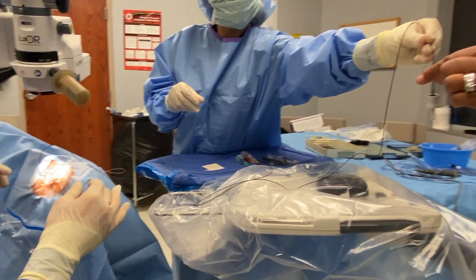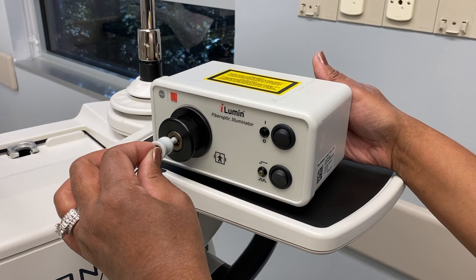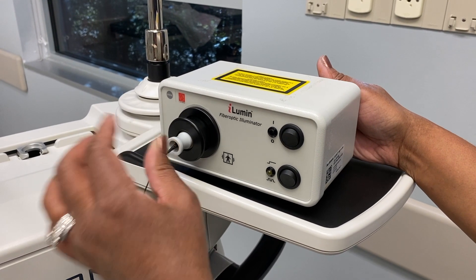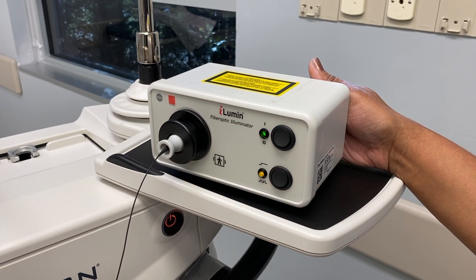The fiber optic connector is then passed off and the circulator snaps it into the black ring of the eye lumen. The upper switch turns the eye lumen on, and the lower switch changes the illumination between steady and blinking.